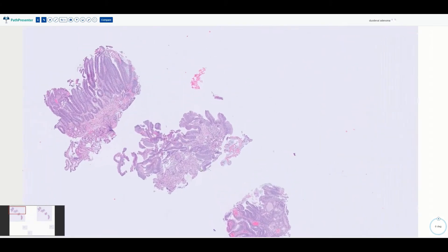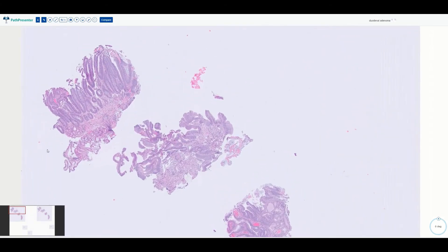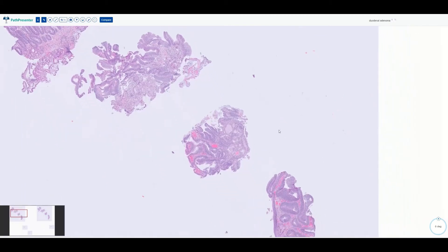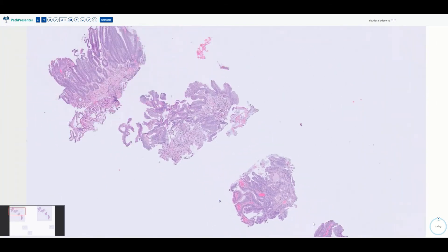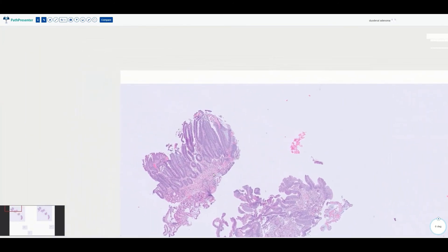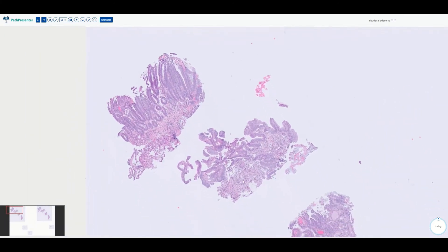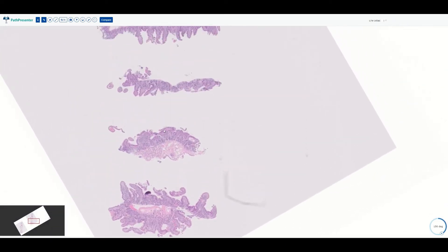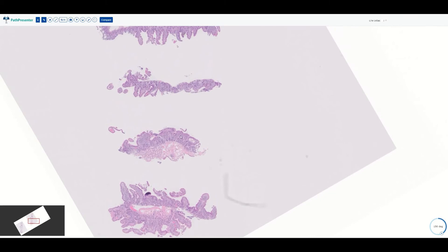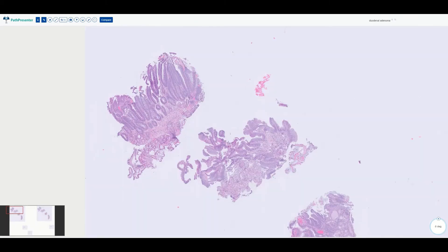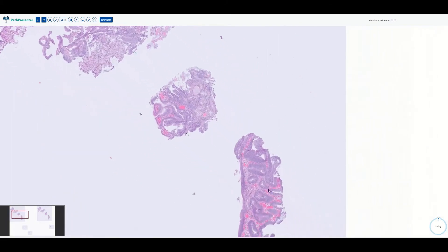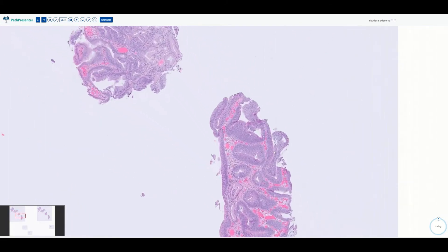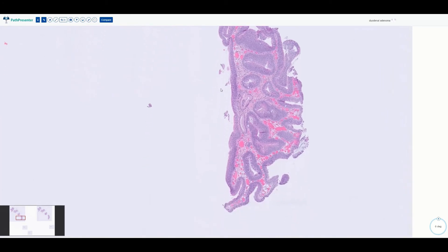On low power we can see some Brunner's glands, so once again we are in the duodenum. At low power, this is really dark — but not in the same way as before. Previously it was the lamina propria that was dark. Here, the lamina propria is actually not so dark — it's still fairly pink — but in contrast, the epithelium is super dark.